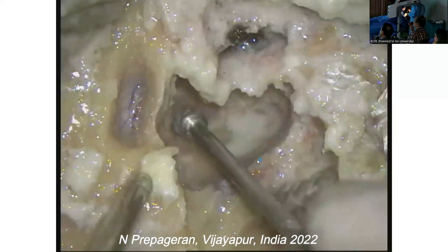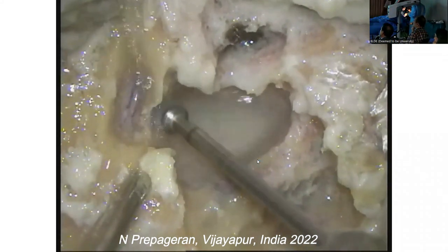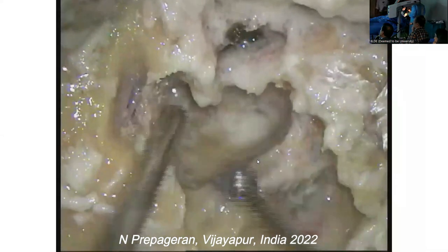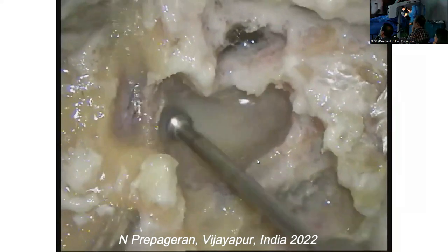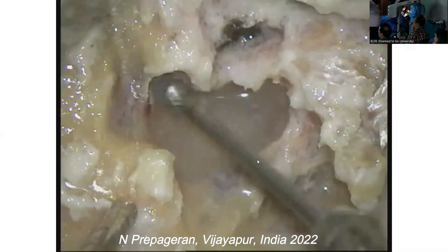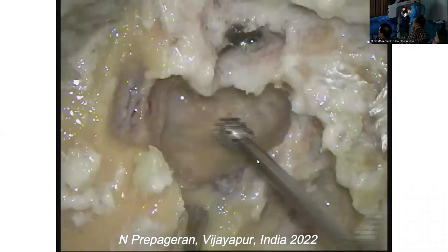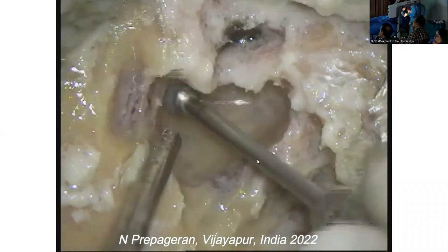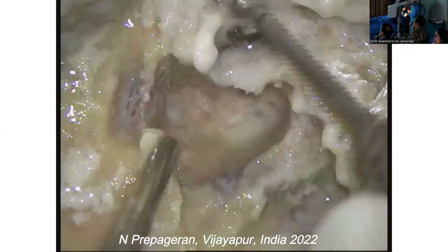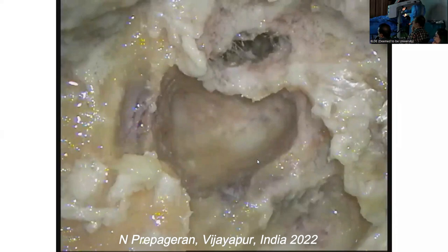So once you know where you're... Remember, this is not a temporal bone dissection. Huh? This is a skull base dissection. The skull base dissection makes all your enemies your friends. And who's your enemies? The dura. So this part you do with a diamond. You don't do with a cutting, okay? I'm doing with a cutting to save time. In real life, I will do with a large diamond.